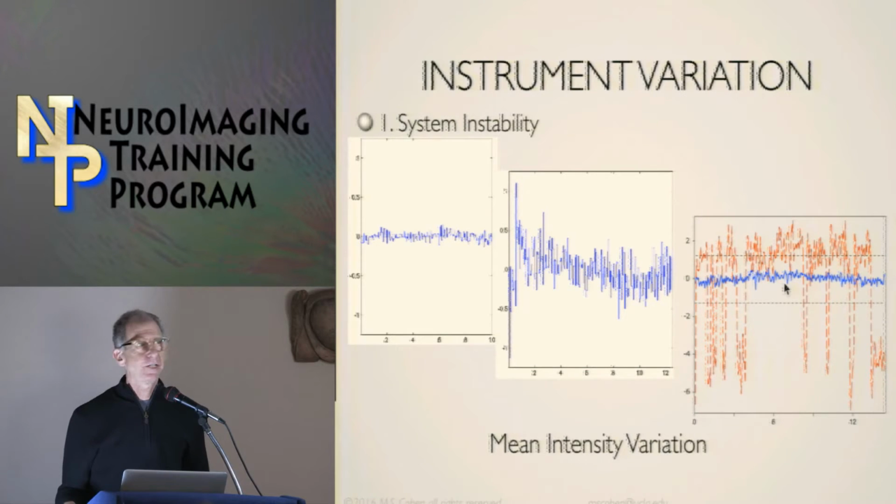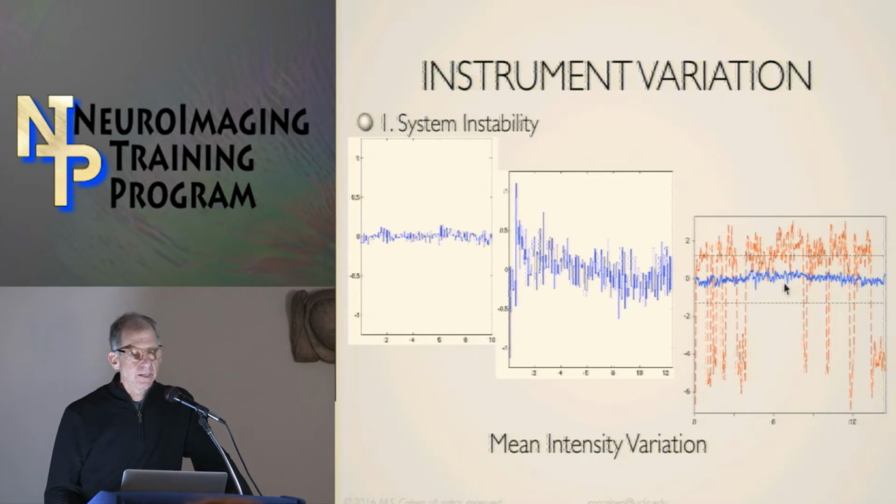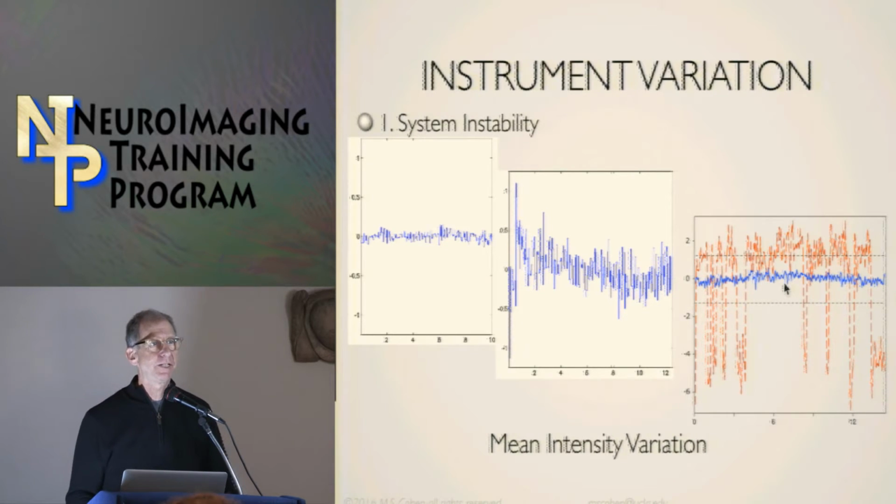So for the penetrations inside and outside of the room, these days our state of the art is that everything is done optically, so that we remove any of these kinds of contact problems. We have isolated power strips throughout the scan room so that when people do randomly plug their stuff in, it's unlikely to produce these kinds of ground loops. But the daily QA is one of the best ways that we have of finding that, because you come in and things aren't working right, and you can see those effects.